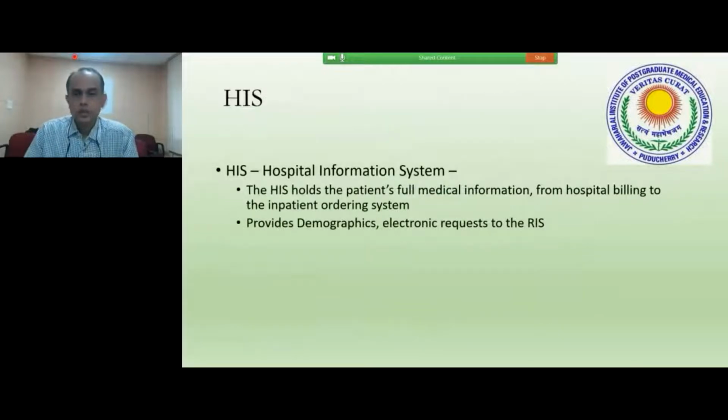Now the PACS doesn't work alone, it has to work along with the hospital information system. The hospital information system holds all the patient's information, full medical information from billing to inpatient order system, the electronic medical record. Why does the PACS have to interact with the HIS?